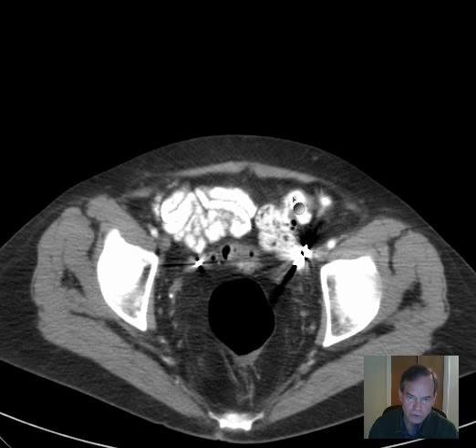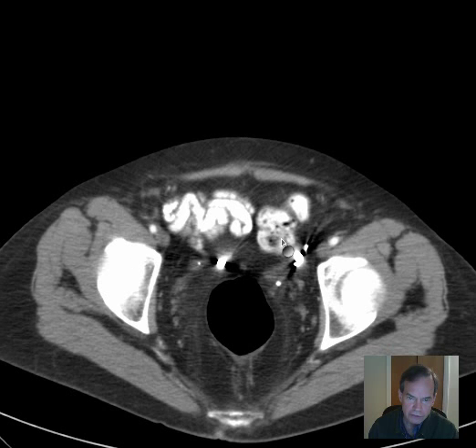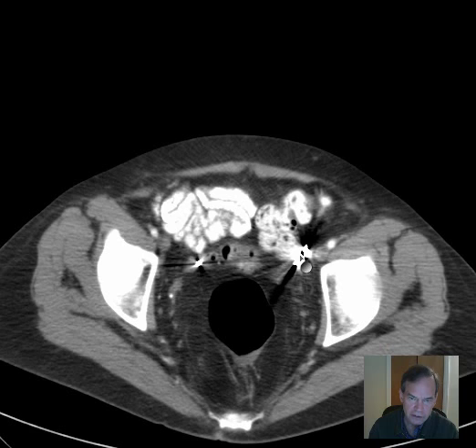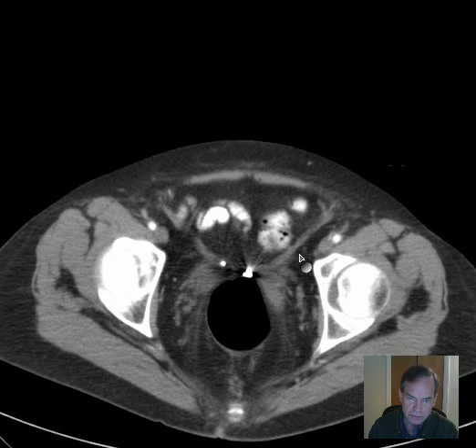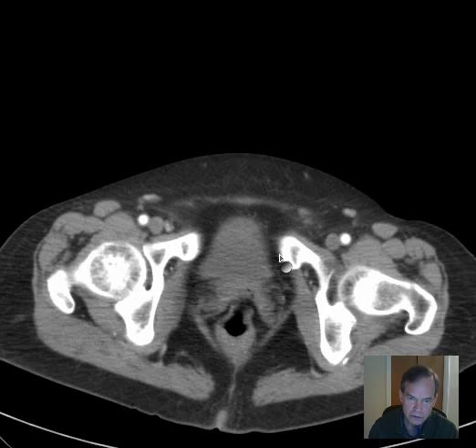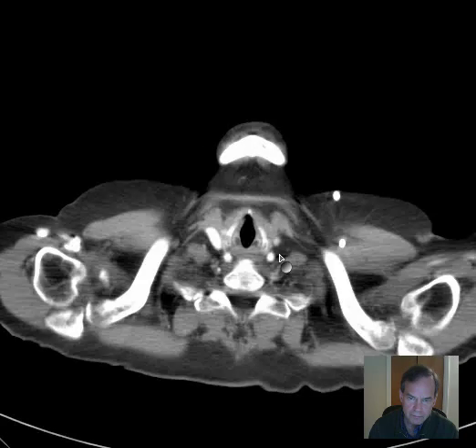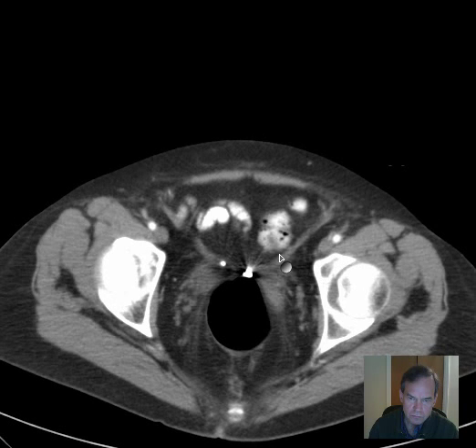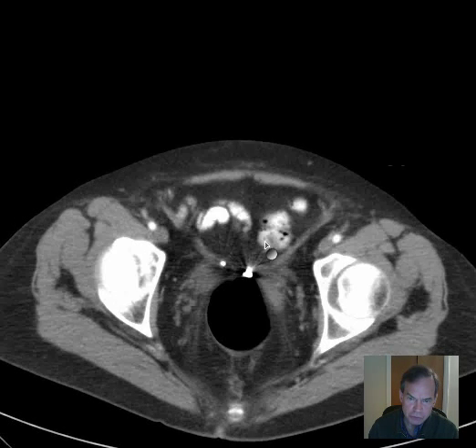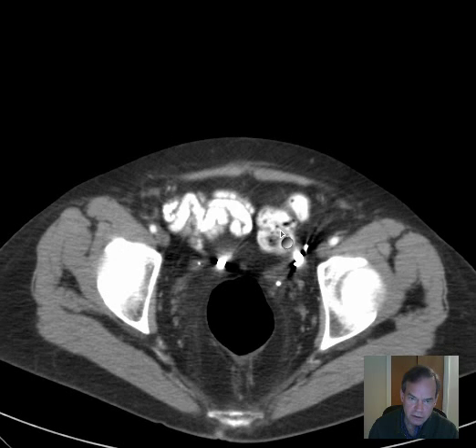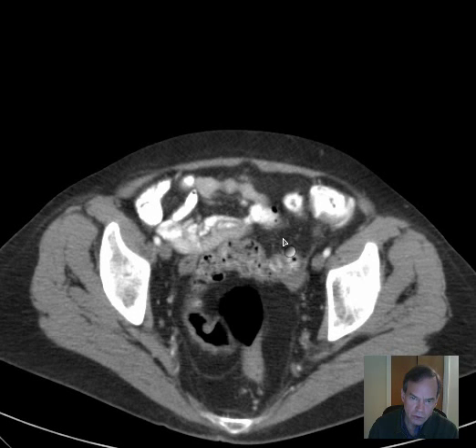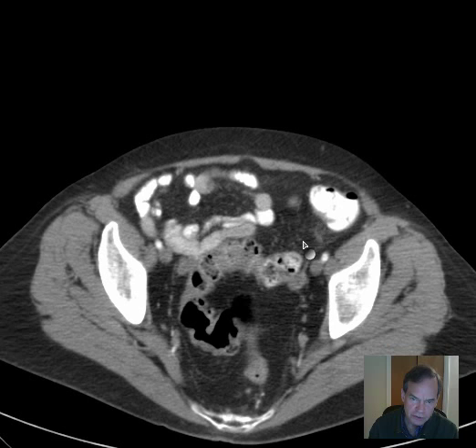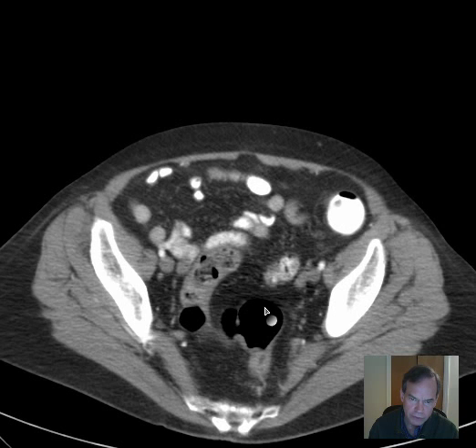Let's look at the sigmoid colon. It turns around here and has a little bit of a sigmoidal configuration, as we would expect. There are multiple metallic surgical clips reflecting prior surgery. As much as we are able to see of the colon — no obvious — and here's part of the sigmoid colon here too, coming into the rectum.